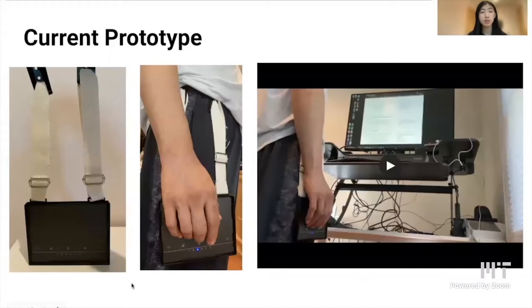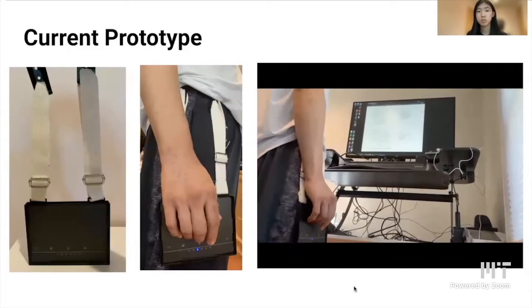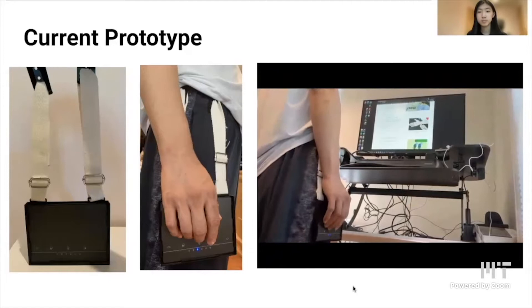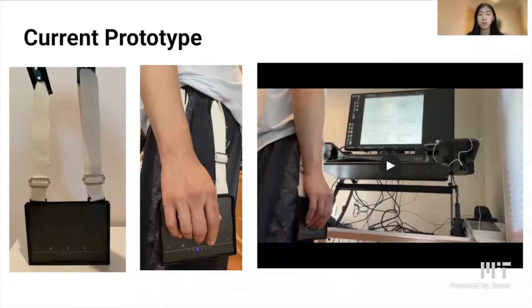This is the prototype I ended up with by the end of the course. Here's a demo video of him using the trackpad and some of his comments on how it felt. 'Yeah, that works. Actually, this is perfect. That's how I would do it. It's very easy.' That is basically a demonstration of how the trackpad works on his own computer with my co-designer.